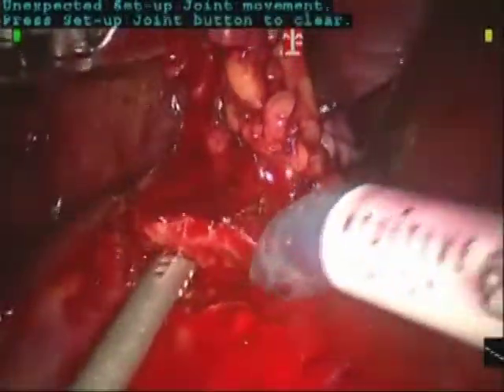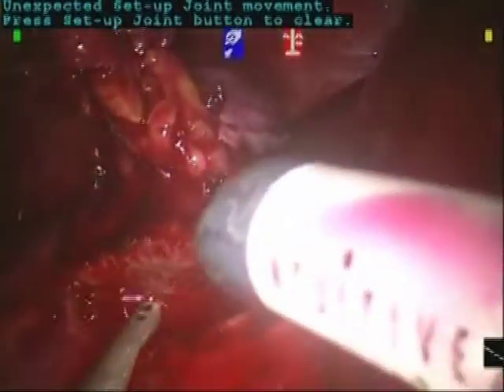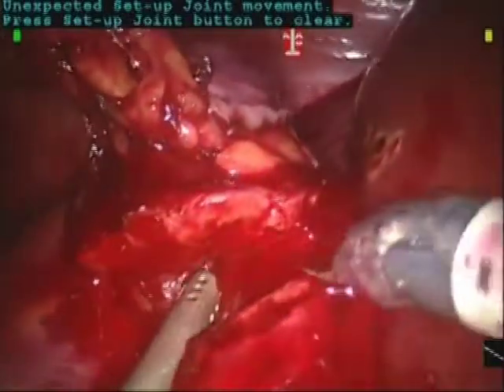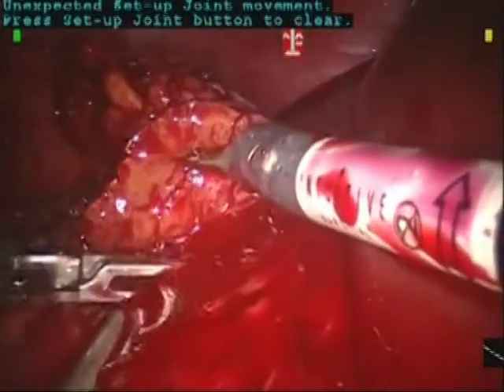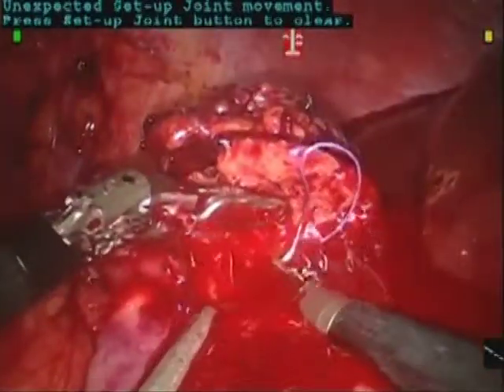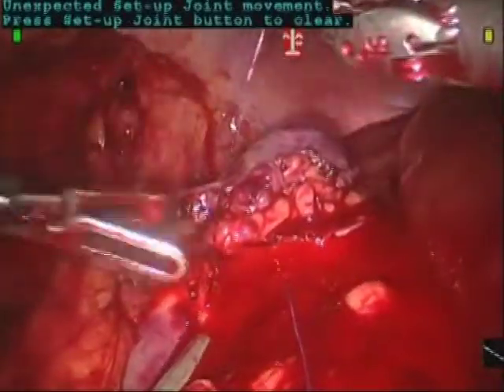Arterial bleeding is encountered. The side surgeon applies pressure on the vessel while the operating surgeon continues the excision to gain better exposure. The vessel is oversewn with a 3-0 vicryl suture.